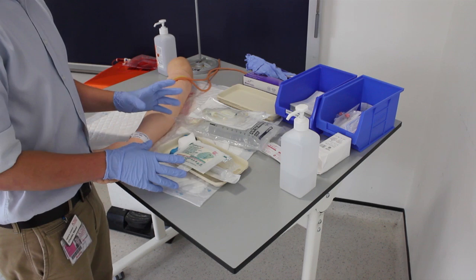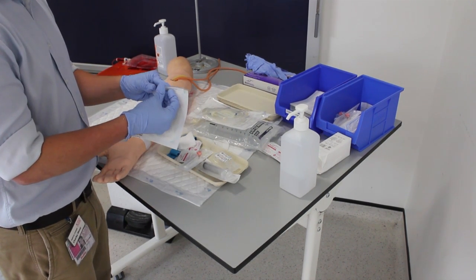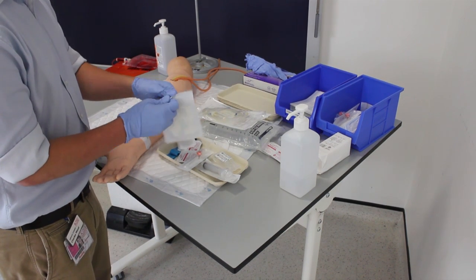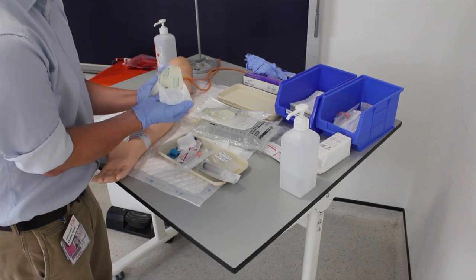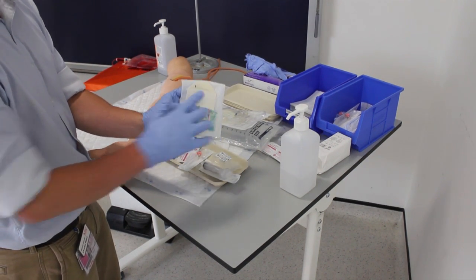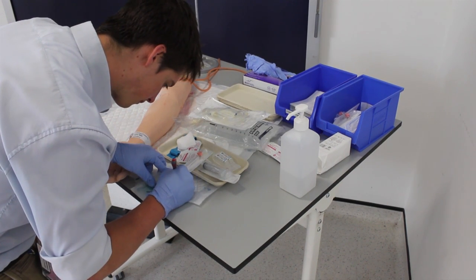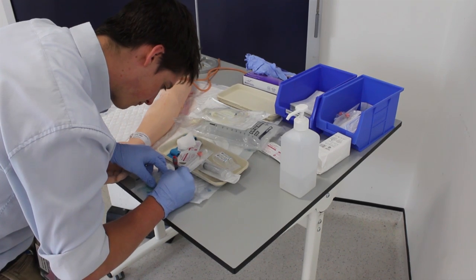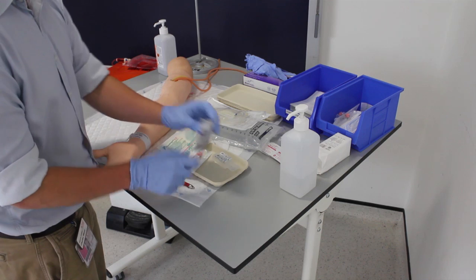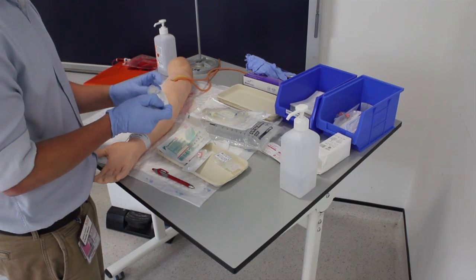Once I've assembled all this equipment, I'm going to open up the tegaderm, as it's important to write on today's date and the time, just so that you know when it should be removed. There's just a place to write in today's date, so I'm going to get a pen and do that now. I'm also going to take this time to draw up some saline in preparation for flushing.